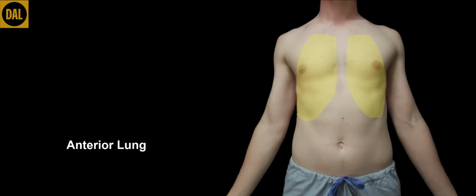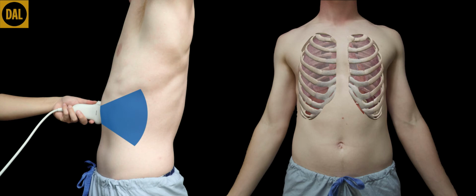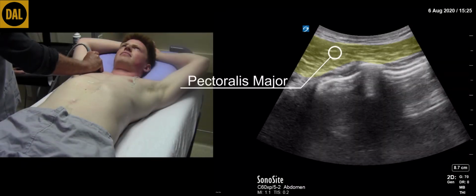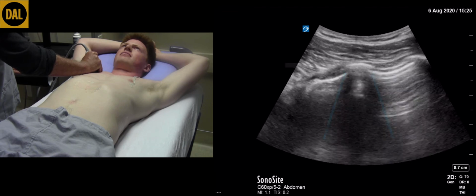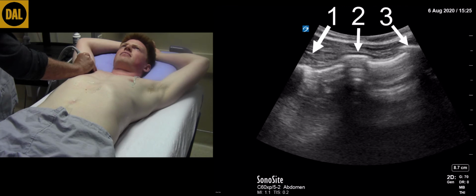Then move the transducer to the anterior chest. The transducer is in the longitudinal plane. Place the transducer in the midclavicular line in the second rib space. Identify pectoralis major and deep to this a rib in cross-section, visualizing the hyperechoic anterior surface casting a posterior acoustic shadow. Slide the transducer caudally to visualize 3 ribs in one view.